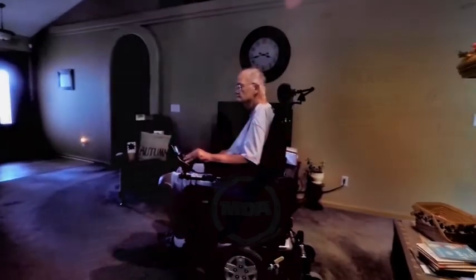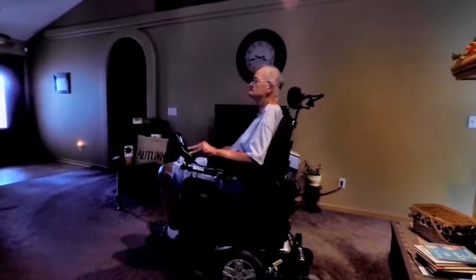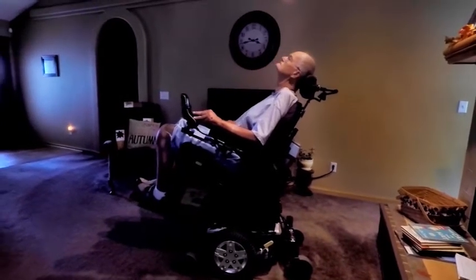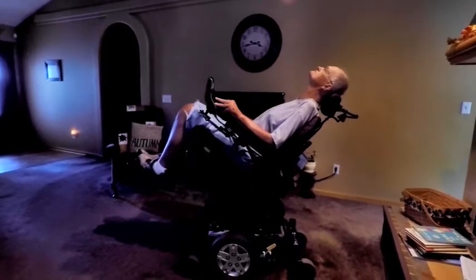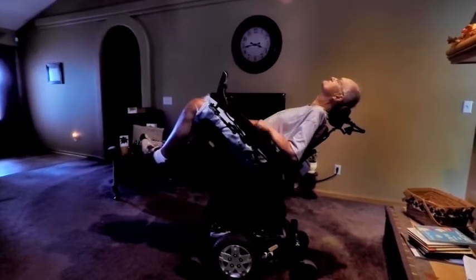If you think you may be confined to your wheelchair for several hours at a time, it might also be advantageous to get a seat tilt function on your power chair. The seat tilt function allows you to lay the seat back to temporarily take some pressure off your posterior. It always feels good if you can take an alternate position, even for just a few seconds or minutes.